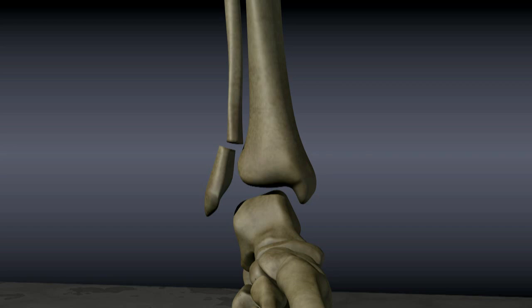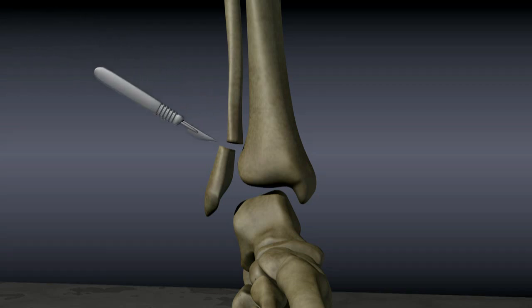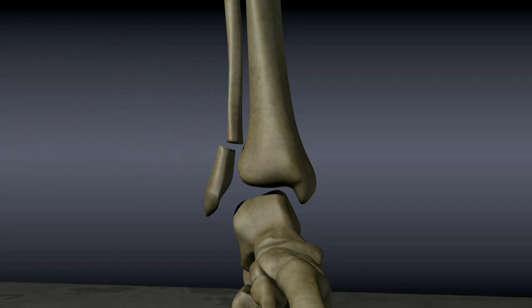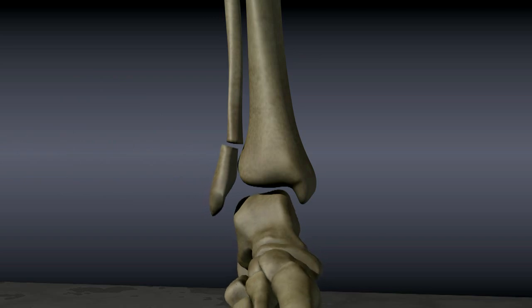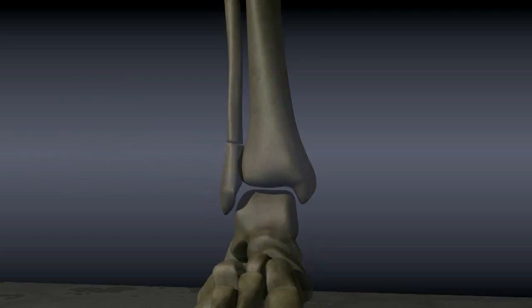An open reduction with internal fixation is usually performed. An incision is made at the fracture site. The fracture is reduced or put back in place. A lag screw is often used to pull the fragments together. A plate and screws can then be used for solid fixation.